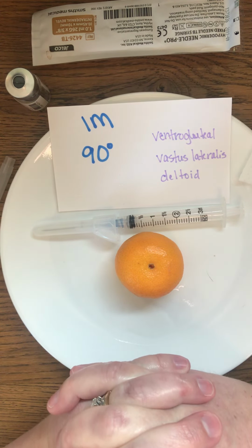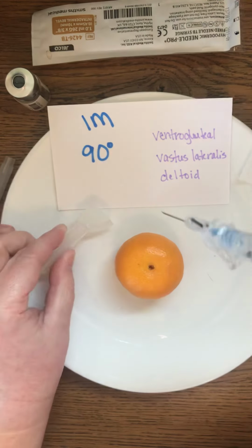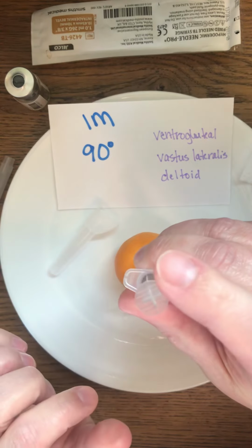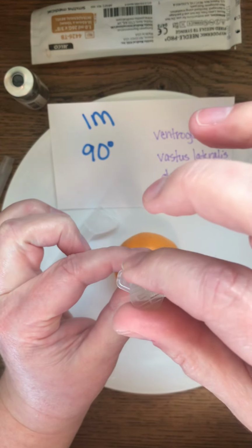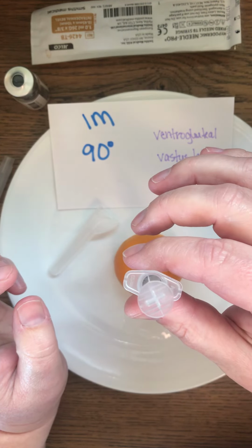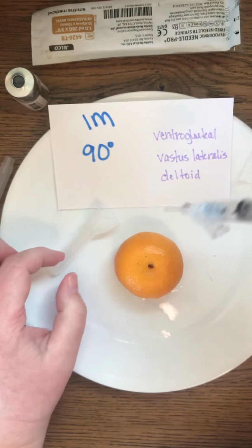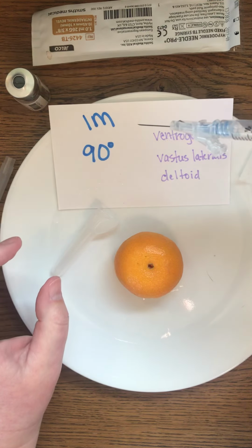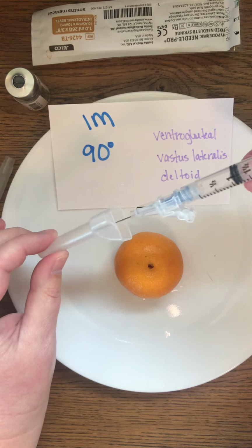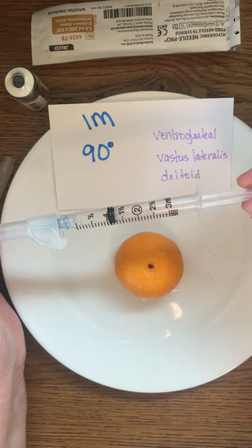In the past, they have recommended to aspirate. What aspiration is, say I have my medication here, and I've poked it in for an intramuscular injection. What they had recommended is that you pull back, and if you got blood up into there, that would mean you were in a blood vessel, and so then you would want to pull out your needle a little bit so that you didn't inject the medication right into the vessel. That is called aspiration, and they no longer recommend that we do that. The chance of actually having it in a blood vessel is very small, and it just is no longer recommended.